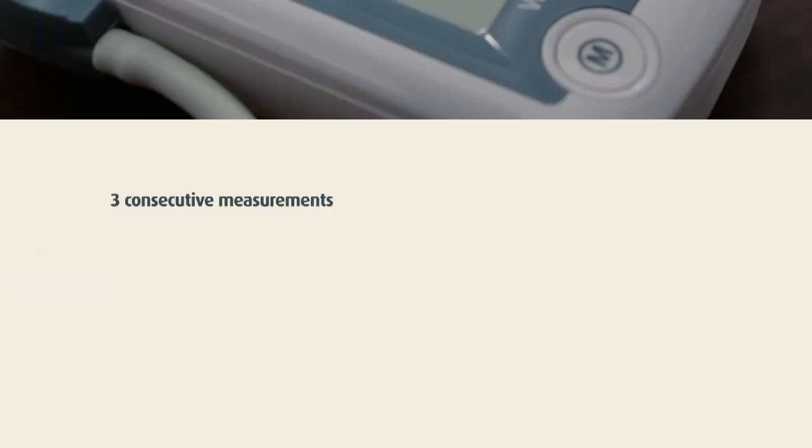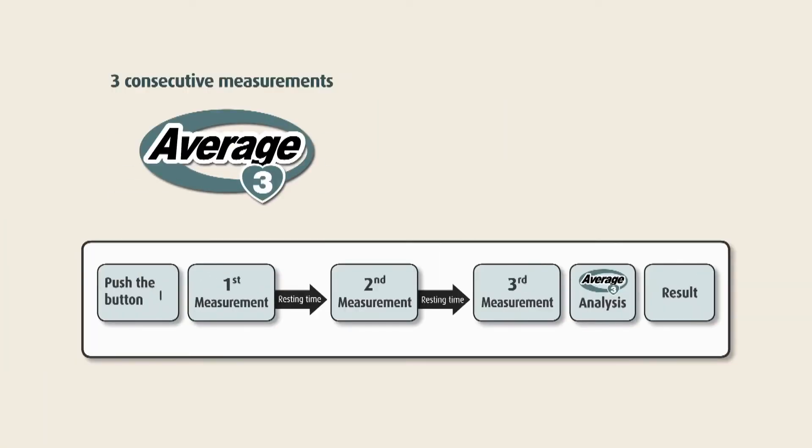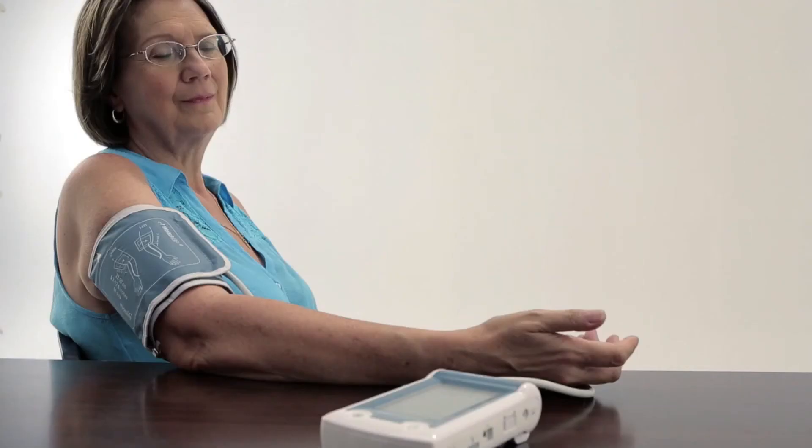Press the start button. Three consecutive measurements are automatically performed to get accurate blood pressure readings. During the measurement, do not move, cross your legs, or tense your arm muscles. Breathe normally and do not talk.